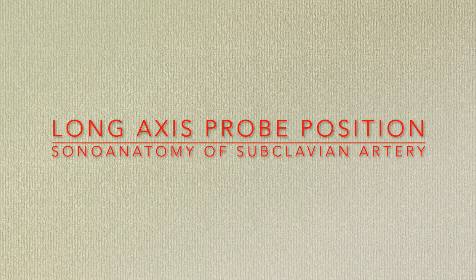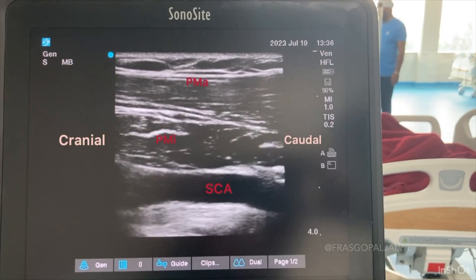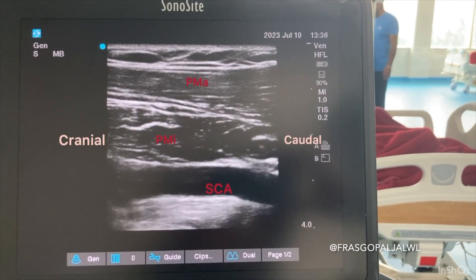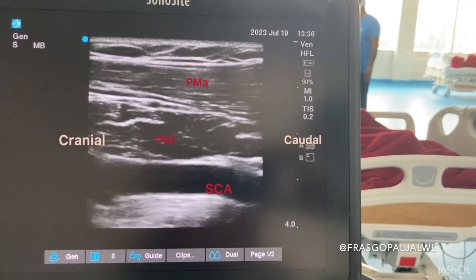You must also know how the subclavian artery looks in long axis view when you place the probe over the axilla, otherwise you risk puncturing the subclavian artery. The subclavian artery will show pulsation in long axis view and looks like a railway track — same width throughout.